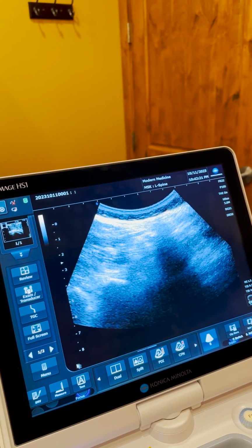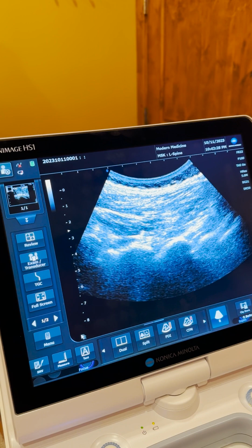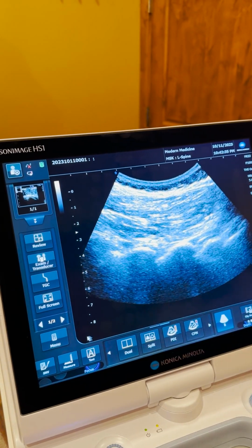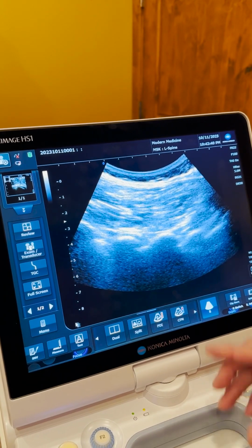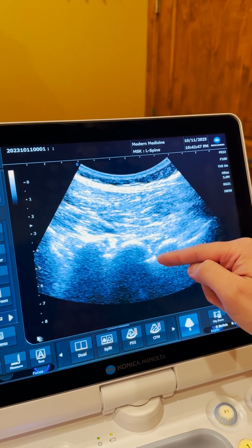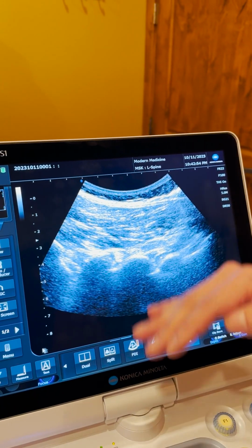But if we wanted to go deeper into really evaluating a facet, we can go on this view. This is the facet, this is the facet. So again, this is the bottom of the body, so sacrum, and the head is going this way. So it would be a lot easier to look at the joint right here, which is a facet joint, either as a true injury or a true area of inflammation or damage. Now, more importantly, we can look at the soft tissue above it, right?